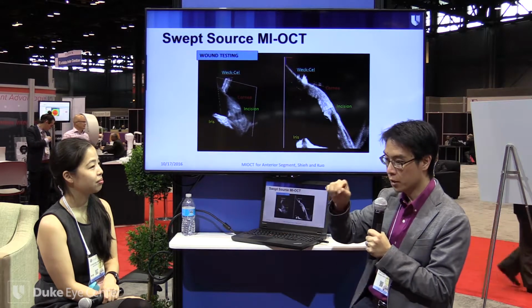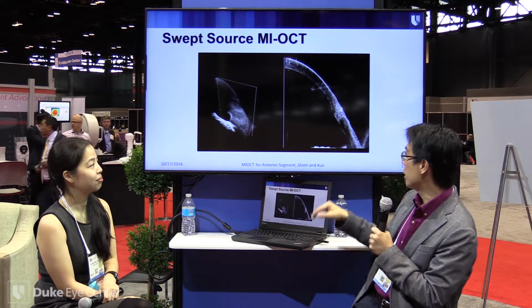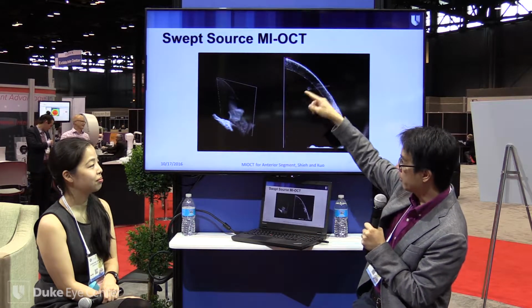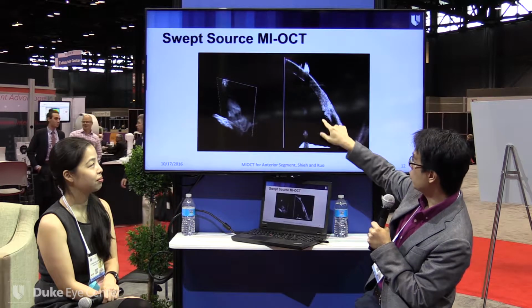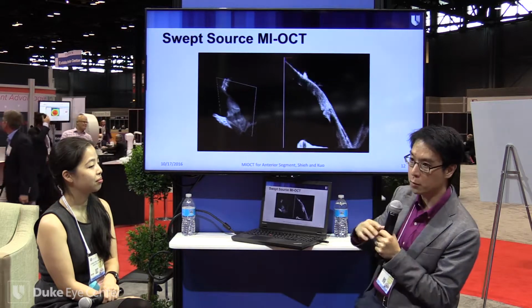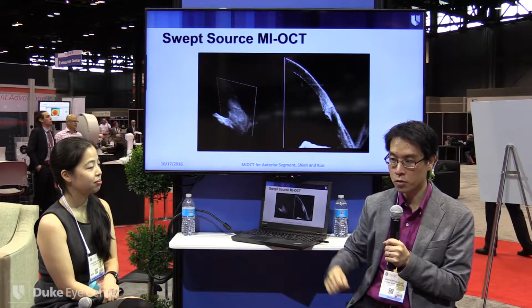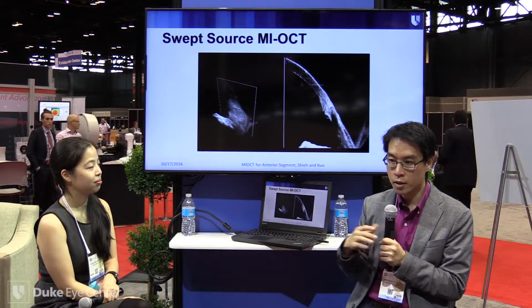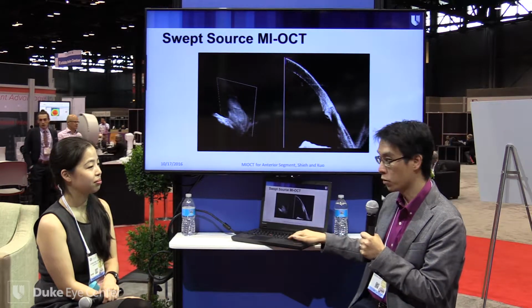So instead of poking at the eye and then seeing if fluid comes out, we can basically directly look at it, and then you'll see we'll have our little Q-tip-like thing pushing on the cornea, and you can see each time the cornea gets deformed, nothing's really happening to the incision. So we know this is a really tight incision. They'll do fine afterwards, as long as they don't rub their eye too hard, versus one where it's gaping open. And so this is a direct way to look at this sort of information.